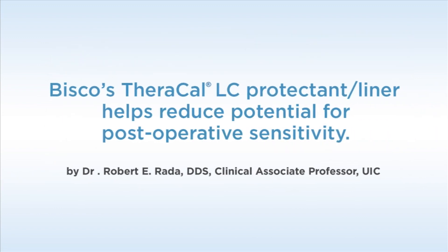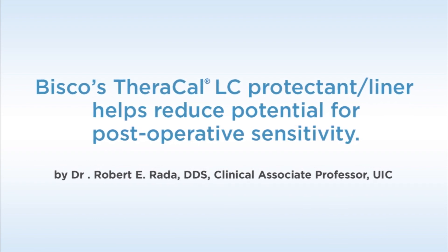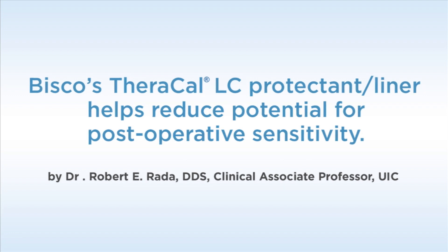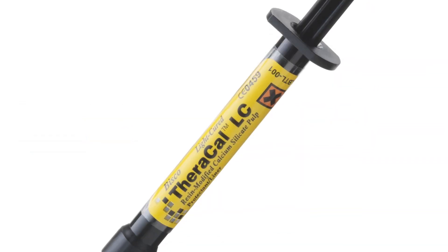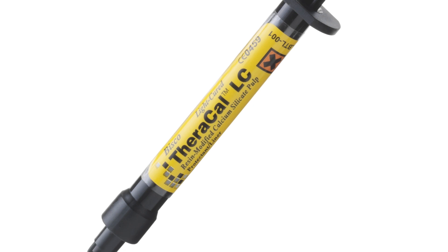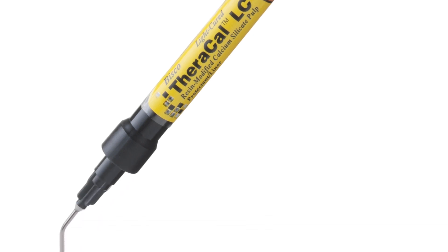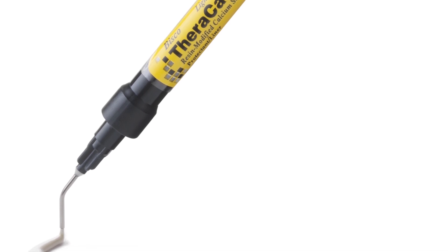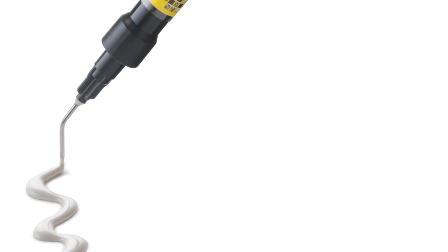The following case demonstrates the use of TheraCal LC as a lining material. The patient presented with a mandibular premolar with a large distal carious lesion. Liners are frequently used beneath dental restorations to reduce the potential for post-operative sensitivity, but take on a much greater role long-term in serving as pulpal protectants. Several qualities of a liner are necessary for effective pulpal protection.